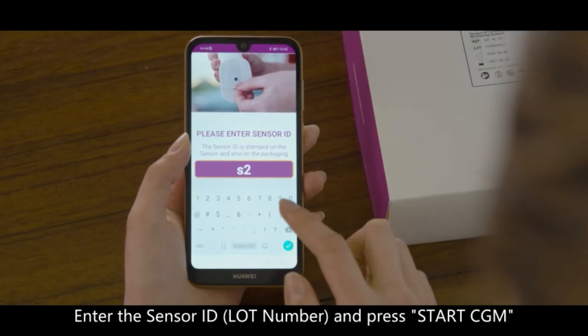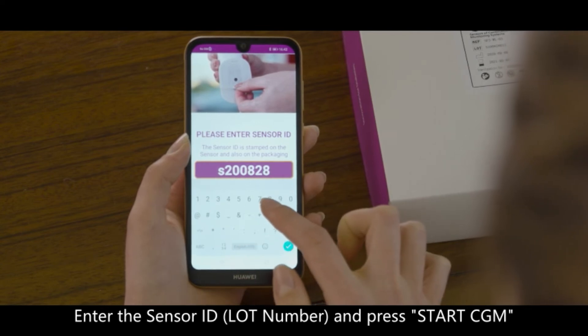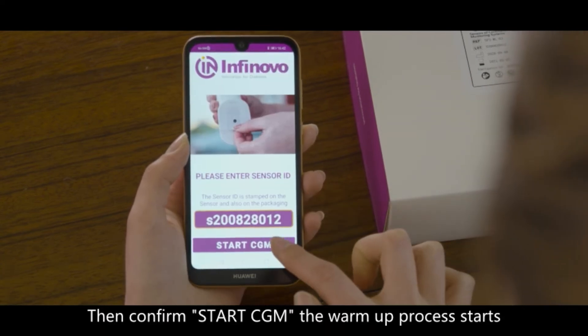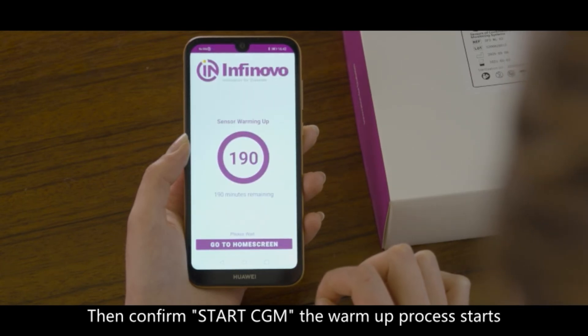Enter the sensor ID, the lot number, and press Start CGM. Then confirm Start CGM. The warm-up process starts.